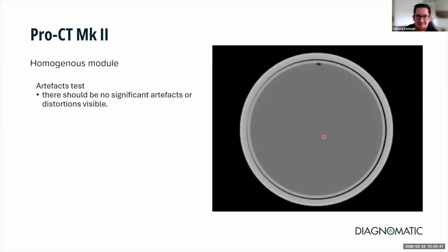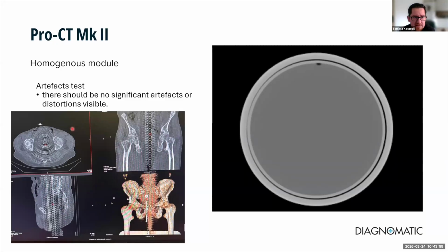The test is that we shouldn't see any artifacts in the image. An example of artifact had been sent to us from a customer.